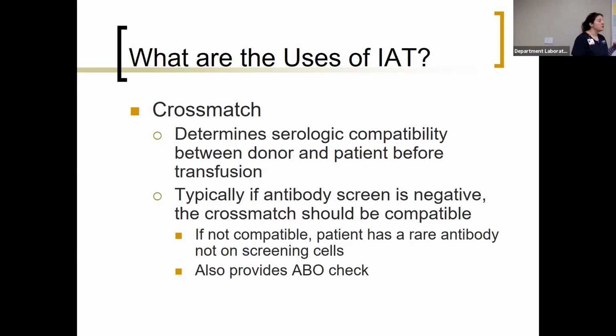And remember I said that if you identify an antibody in your patient, then you have to do what we call an AHG cross-match. You have to go through all 3 phases.